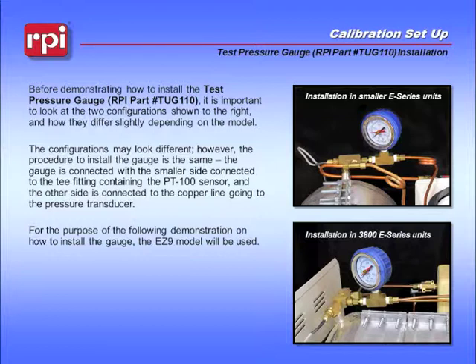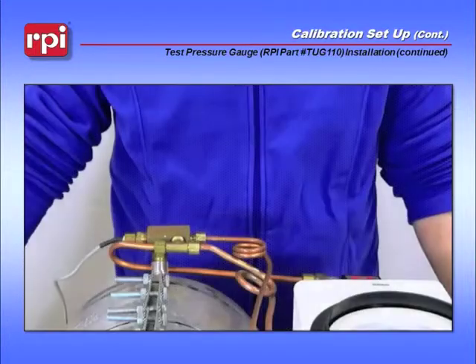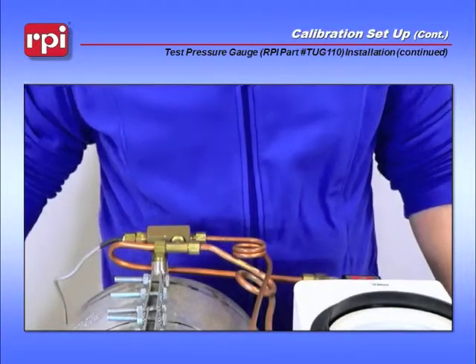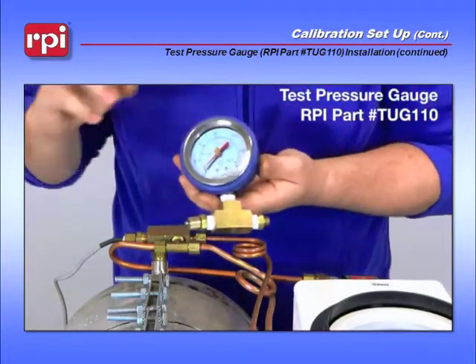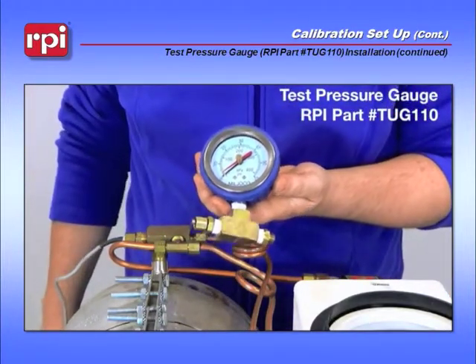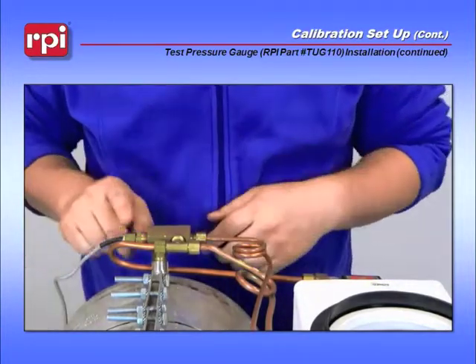For the purpose of the following demonstration on how to install the gauge, the EZ9 model will be used. The first part of calibration setup is to grab your test pressure gauge, the TUG110, and install it in the small T in the back of the machine, where your temperature sensor is located.